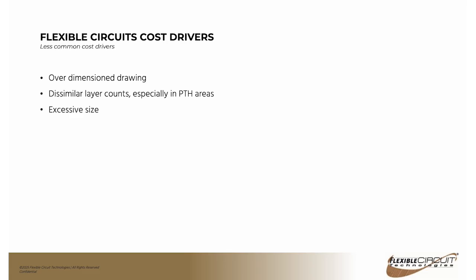I think the industry has found overall that once you drop under 100 microns for via size, it starts to affect reliability. So we typically try to be 125 to 150 microns on our via size whenever possible. We formed down to 50 micron before, but it can impact reliability. You have to keep in mind that these are drilled with lasers that are focused, and so it's not a straight collimated beam. It's a focused beam, and so they are going to be tapered a little bit.